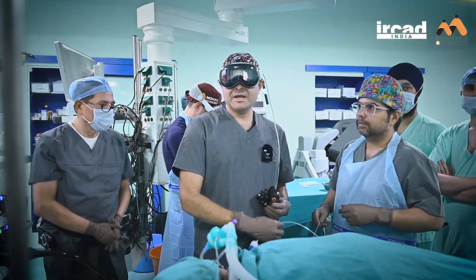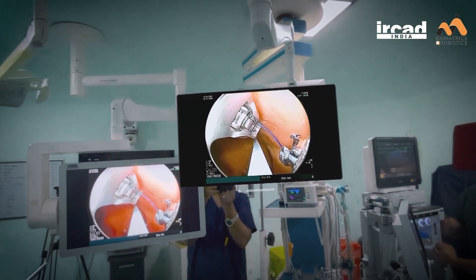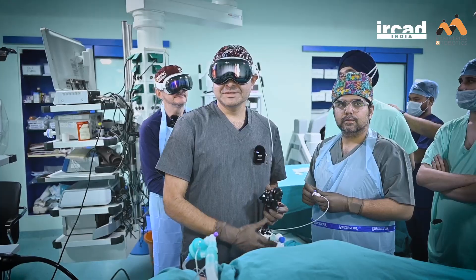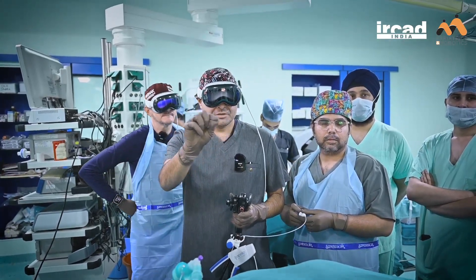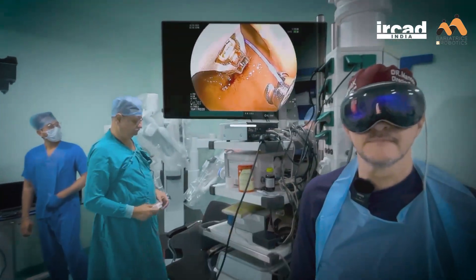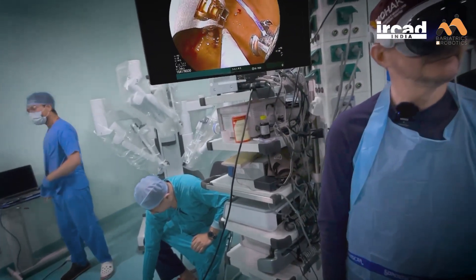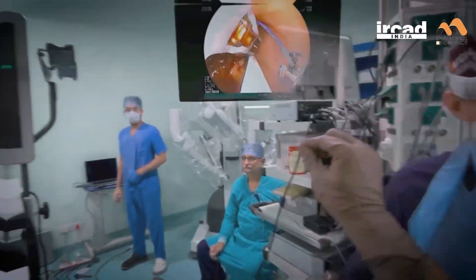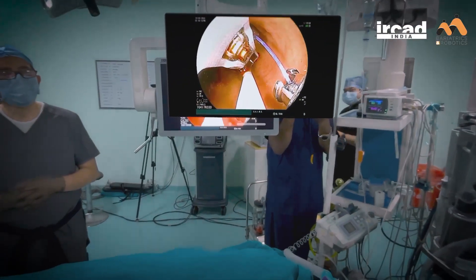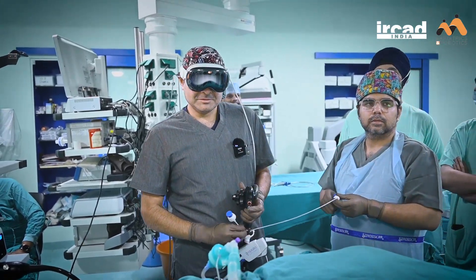At the same time I have complete control over my surroundings. Mohit, I see what you see — beautiful image. Now I want to go posterior, so I'll bring the screen here. My screen is just in front of you, so I'm seeing here what you're seeing here. I have it here, Mohit has it here, and then I can take it back again. We are not using any of the rear screens — we can even take them down.